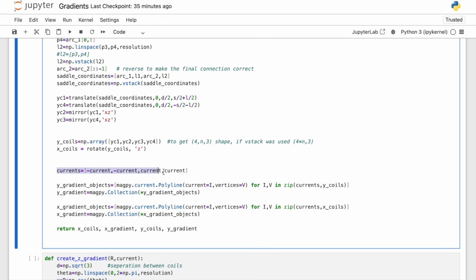Then I have the list of currents. So my first 2 currents, or first 2 elements, are negative, the last 2 elements are positive. This is to achieve increasing or additive and subtractive fields. And then I just assign my currents in order to y gradient objects and x gradient objects. These objects are now Magpylib objects, and I create them using the current.polyline function, and the current is the I, which is defined in this currents list, and vertices is v, and v is in y coils, which we just defined here.